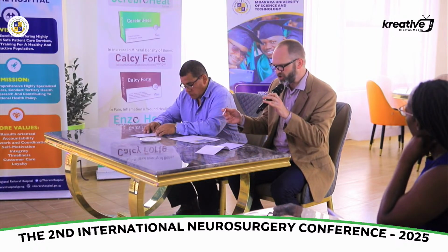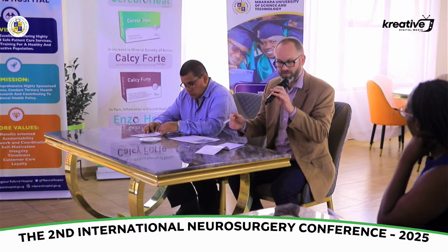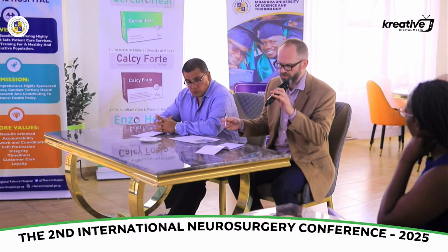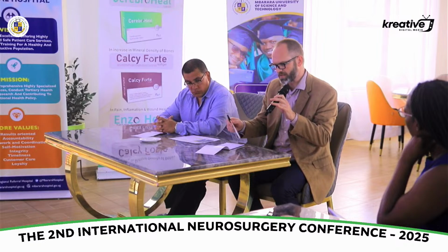Optic nerve sheath diameter can also be a surrogate, so you can use ultrasound to measure the optic nerve sheath diameter. Diameters over 6 millimeters are highly correlative, but you have to know how to do that to be safe with the orbit, using ultrasound on the orbit. So contrast we've talked about briefly. That was the third question that I had.